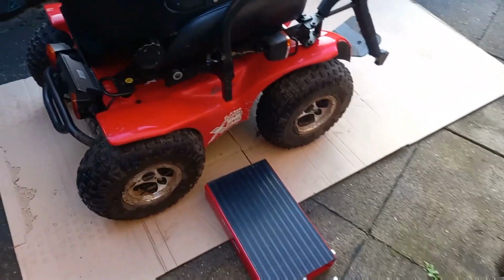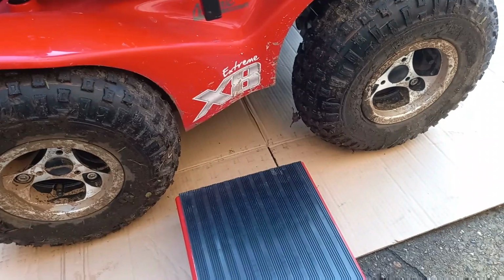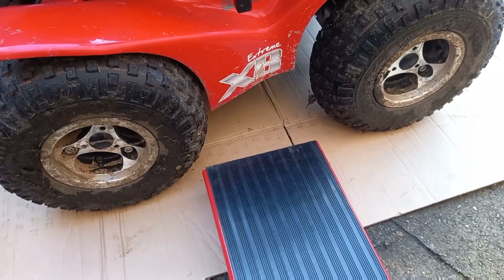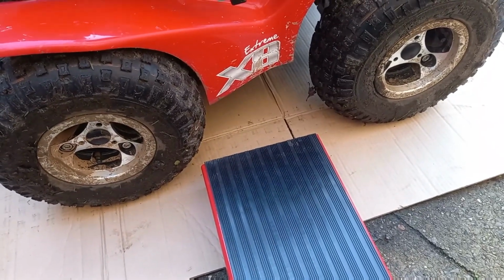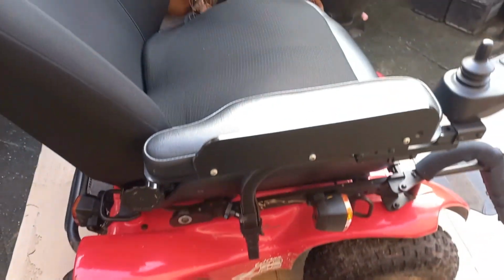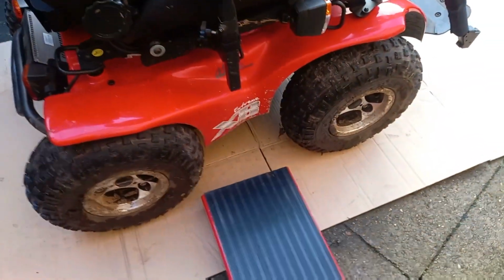Job for today is changing the batteries on the Magic Extreme X8. They've not been lasting terribly long, and we're loath to go further afield on it at the minute, so we bought some new batteries and we're now going to attempt to change them.